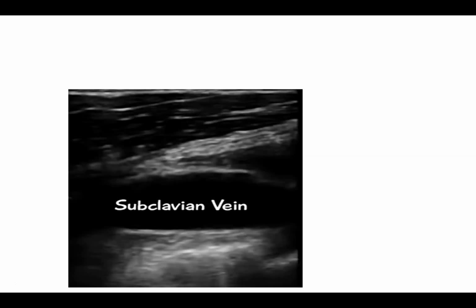So this is what I talked about as the subclavian vein. This is the longitudinal view. And when you go into the longitudinal view, you have to slice as your needle goes in. You should be able to see the tip of the needle. That is the key thing for this puncture. If you are not seeing the tip of that needle, withdraw it back and advance it along the line of the ultrasound for you to visualize it, so that once you get into the vein, you know that you have entered into the vein.